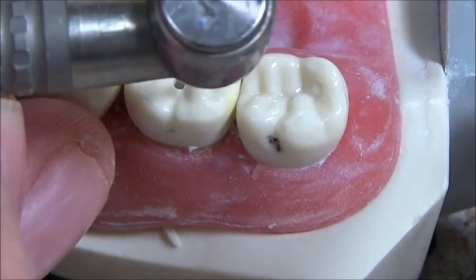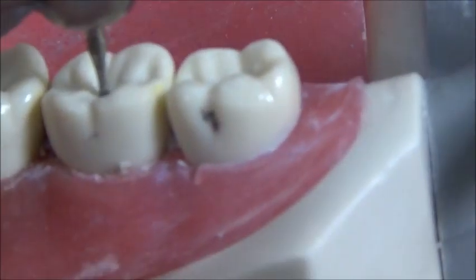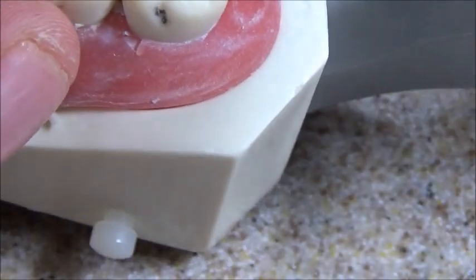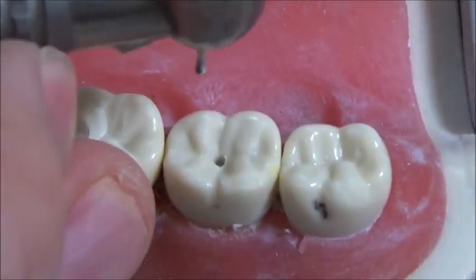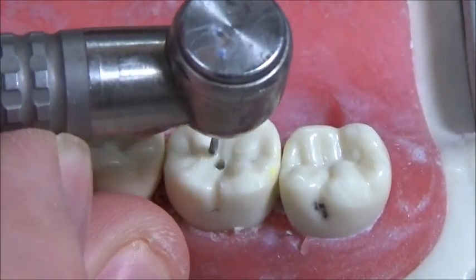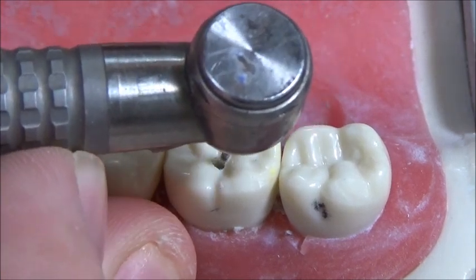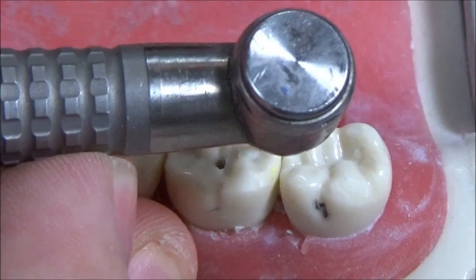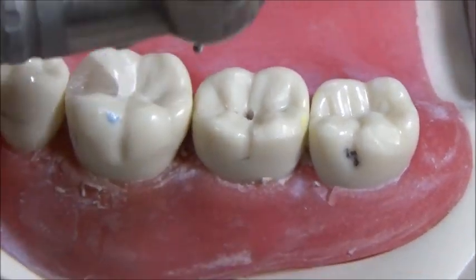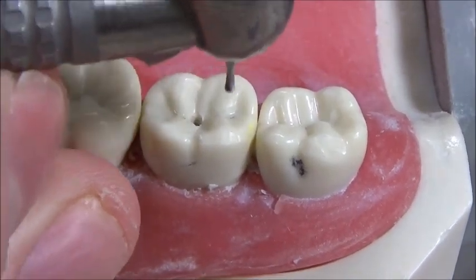As you can tell, I've made my punch cut down probably to about two-thirds of the way down the cutting surface of the burr. Once we get here, it's a lot easier to go ahead and move laterally. Instead of coming in cutting shallow and then going down further and cutting again laterally at a deeper depth, it's easier to do the plunge cut down to where you want it and then move laterally.